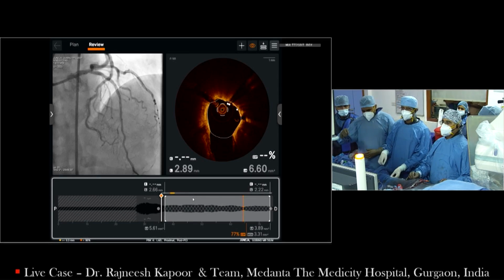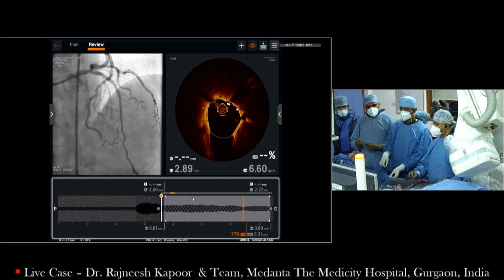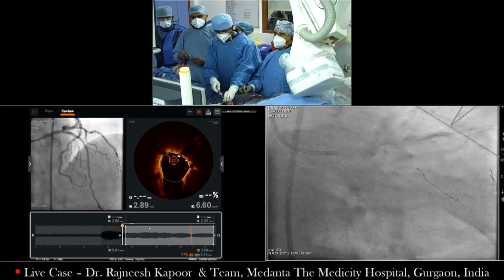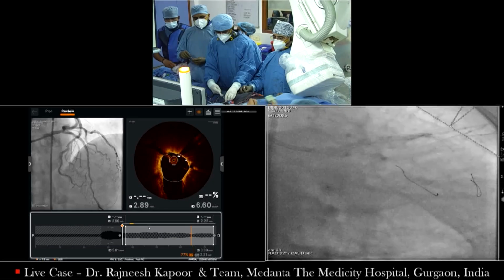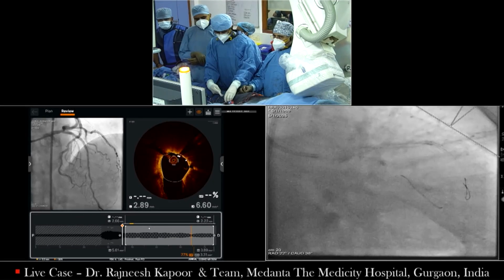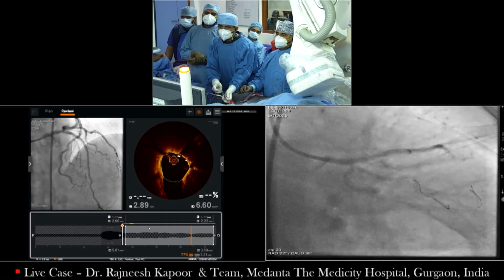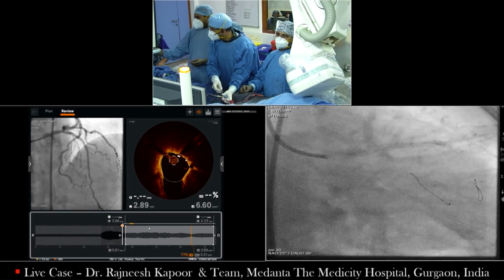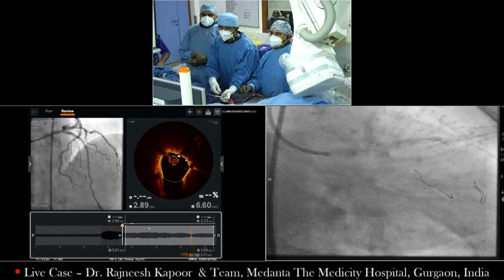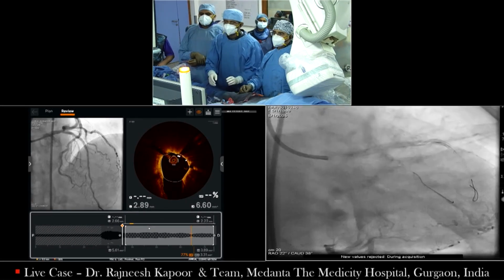So the advantage of that drug-eluting balloon is that you can do multiple inflations rather than just one inflation. Yeah, there's a Protege, which we do not have in the United States. Yeah, we do have it. So you do it at different pressure inflations, at low pressure and high pressure. 3 times you can do it. You essentially can use it for 2 lesions. Yeah, you can inflate 3 times. Okay.